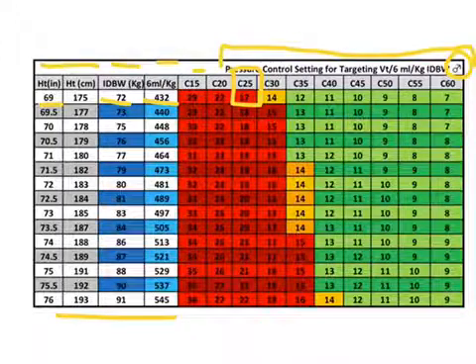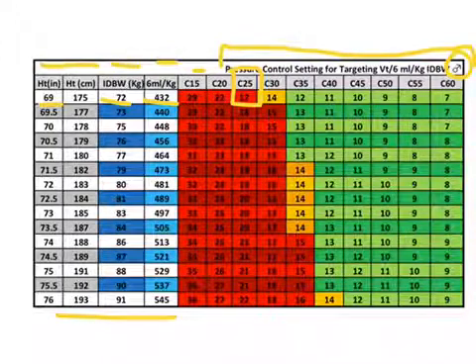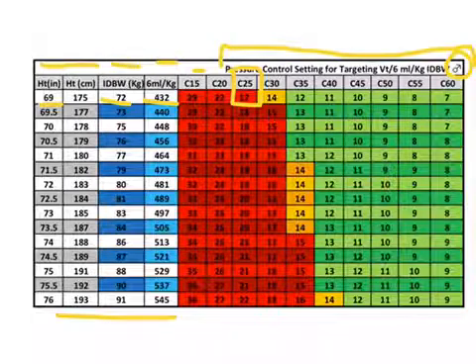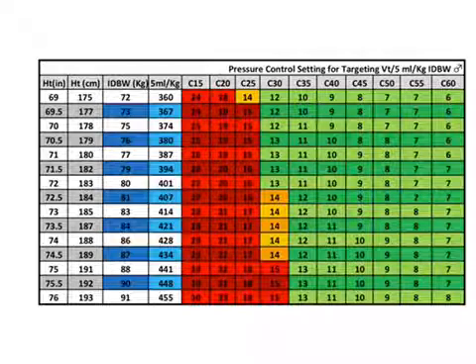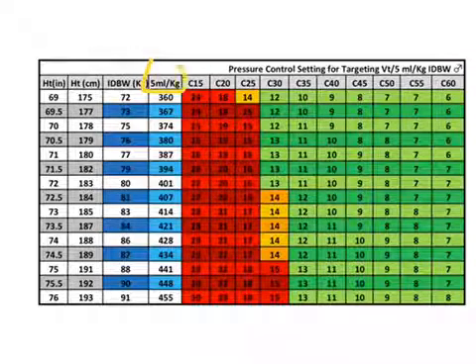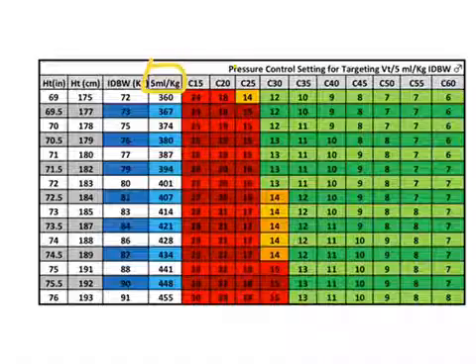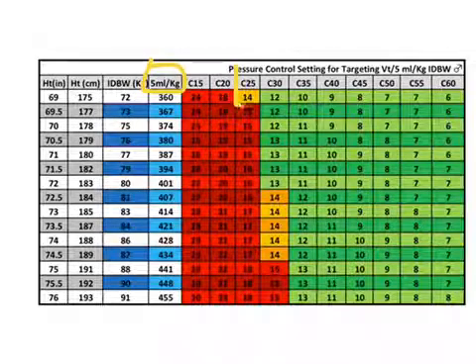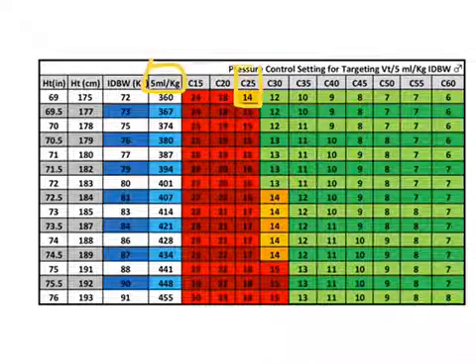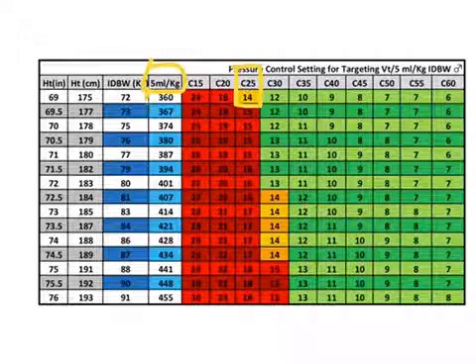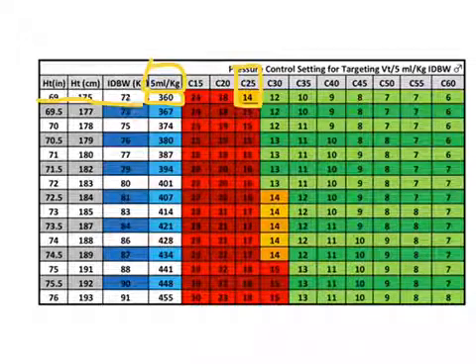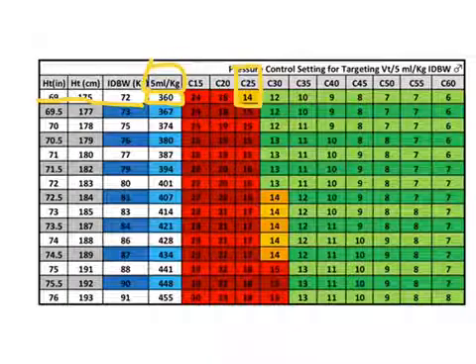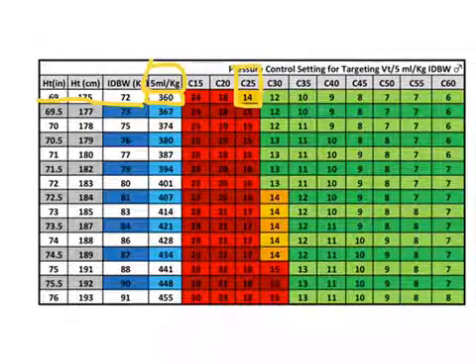So, let's look at using five cc's, this is the same patient and now we're targeting five cc's. For that same compliance at 25, you notice that we are able to maintain that target tidal volume per height and per weight and my driving pressure is only going to be 14 centimeters of water.